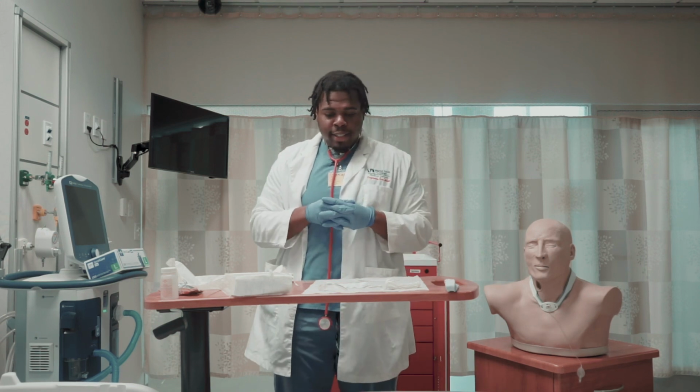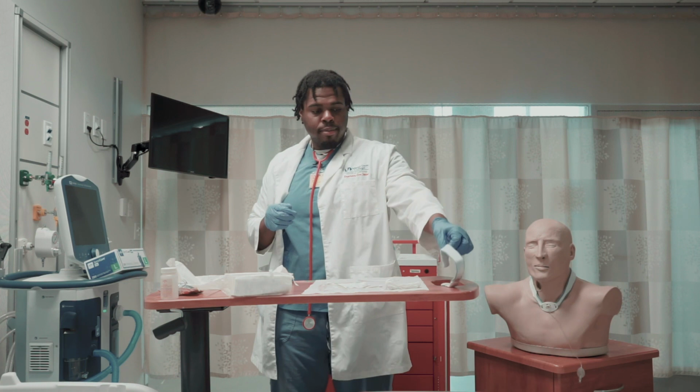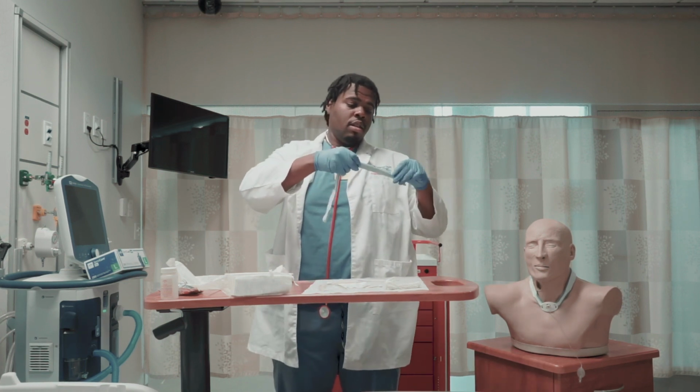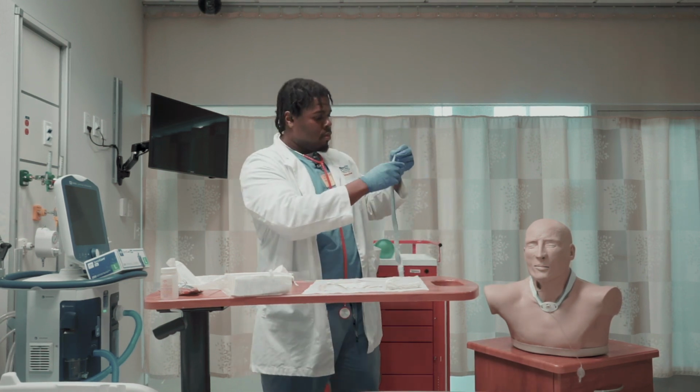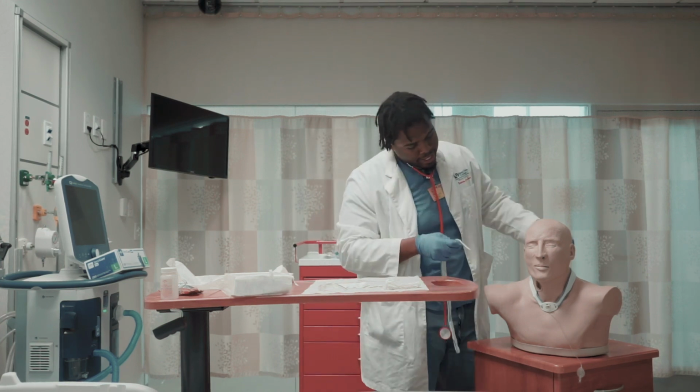Now that I've done that, I'm going to change his trach tie. Remember to hold on the flange.